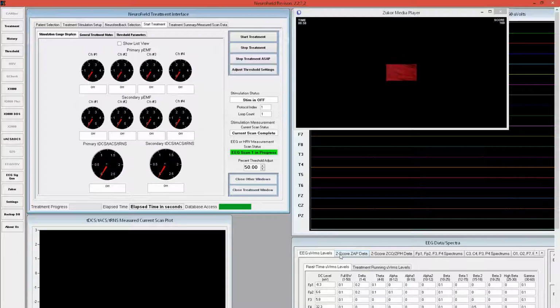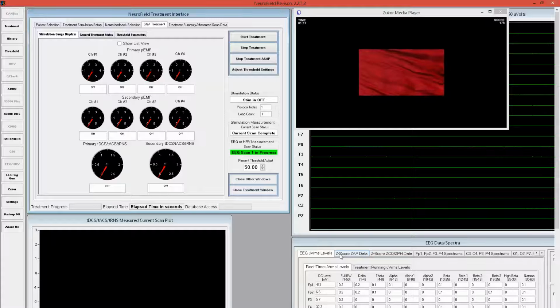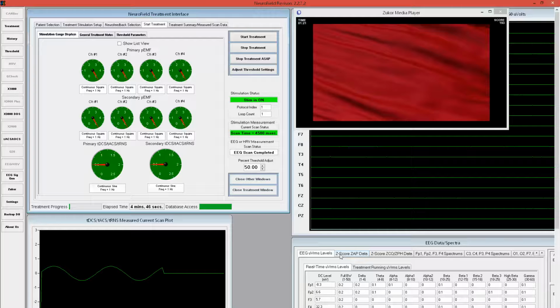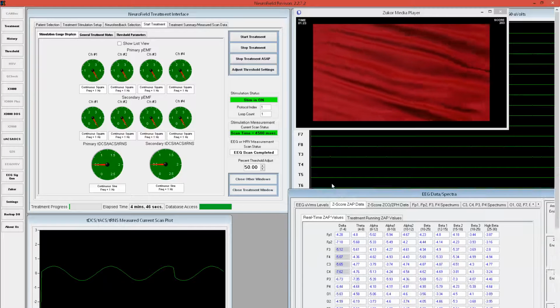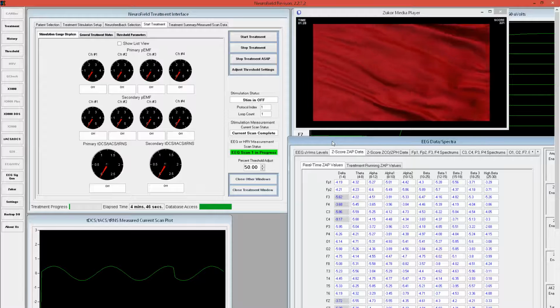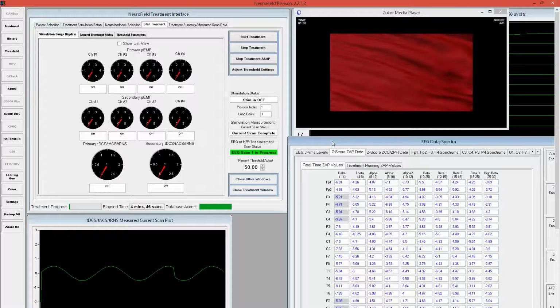At the end of every 32 seconds with RTZ, you do get a stim. While the stim is being given, Zukor will be fed a 100% reward, because we want to pair 100% reward with the stimulation. And so at the end of the first treatment round, you'll see Zukor is getting big there, and then now here's the first stim as it's being given, and you can see our Z-scores now. And you can see here our Z-scores are not being met. We have a really low delta Z-score.